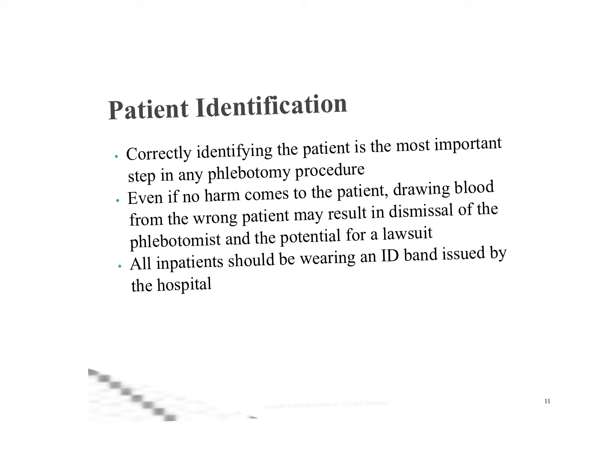All inpatients should be wearing an ID band issued by the hospital. So that's where we need to verify with the requisition form, their ID band, and having the patient state their full name and date of birth.